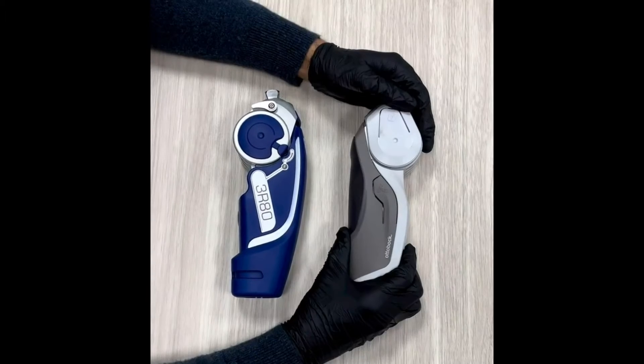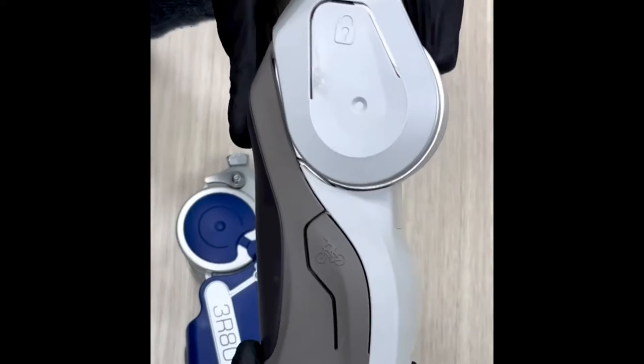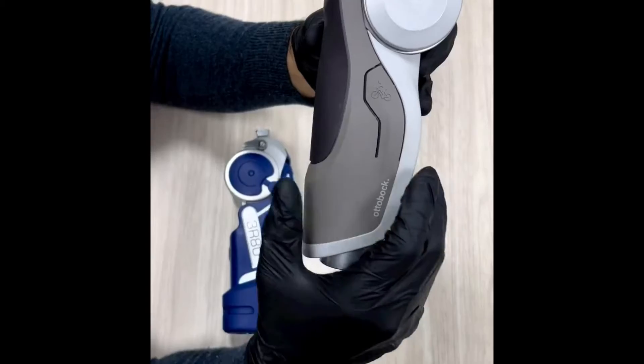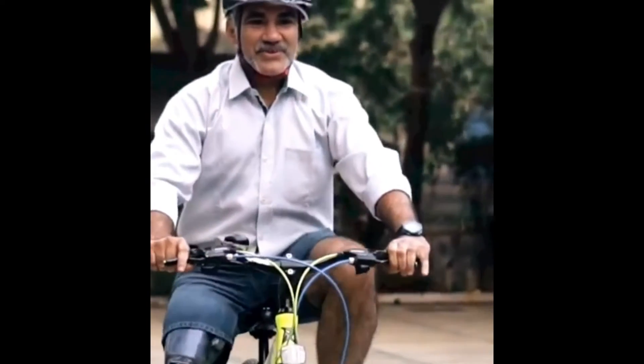Stance phase damping is activated when bearing weight on the prosthesis. The activation threshold is adjustable. It provides for stance phase flexion up to 4° while bouncing and more than 4° while yielding. Walking on slopes and downstairs step over step is therefore possible.